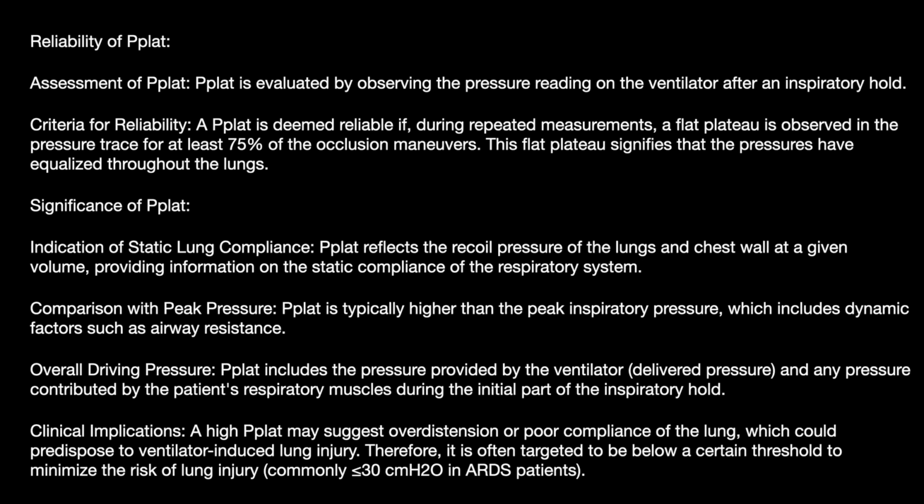A higher P-plat may suggest overdistension or poor compliance of the lung, which could predispose to VILI. Therefore, it is often targeted to be below a certain threshold to minimize the risk of lung injury. Commonly, it is 30 centimeters of water in ARDS patients.